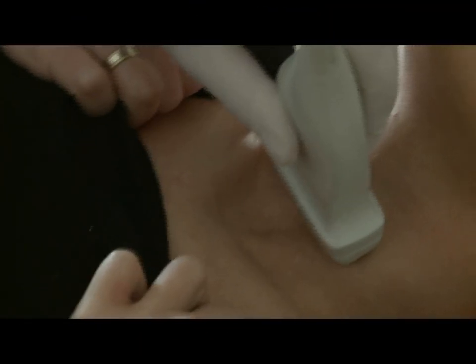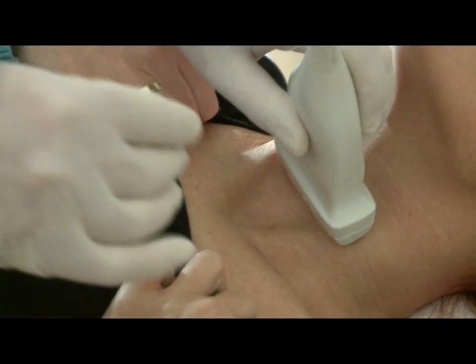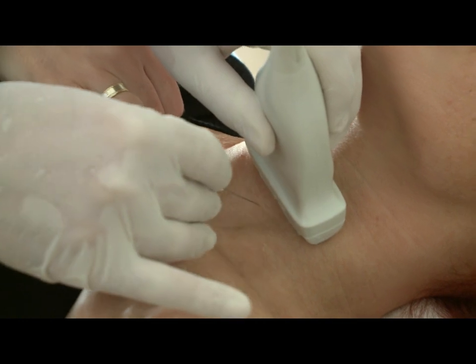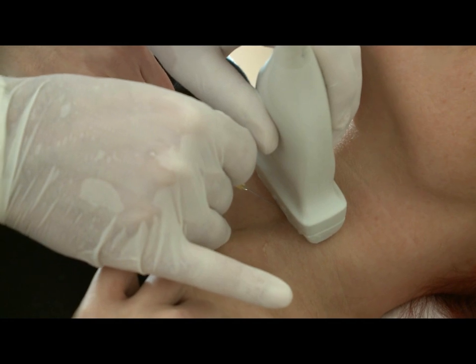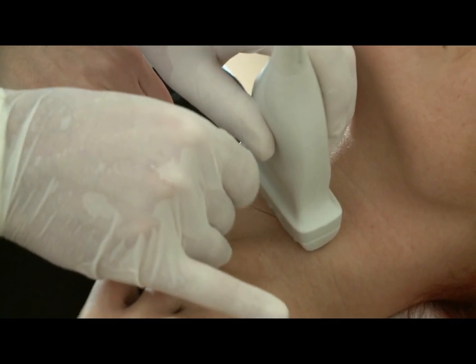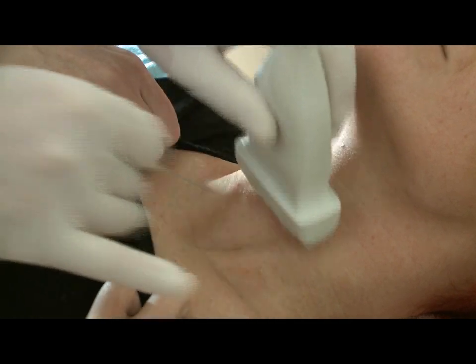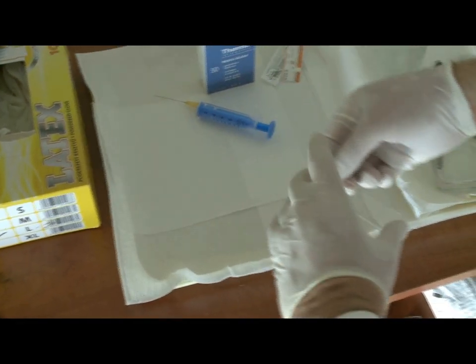Let's see how to perform non-aspiration sampling. First, we search for the adequate position and insert the needle. When you have reached the nodule, move the needle within it several times to get as much material from the nodule as possible into the needle. Then we put the needle into a syringe and perform the usual phases of smear preparation.